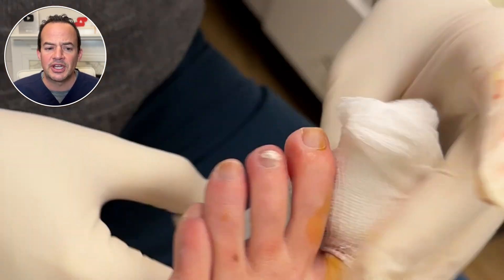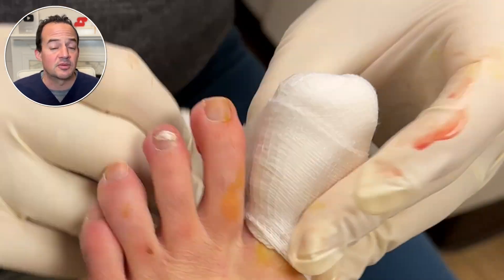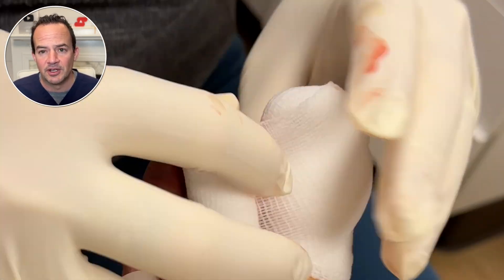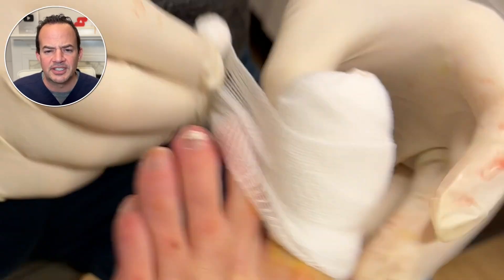I've just applied a petroleum-impregnated gauze so that when the bandage comes off it doesn't stick to the nail bed underneath. This patient will be back to walking and normal activity in about two weeks, sometimes even sooner.